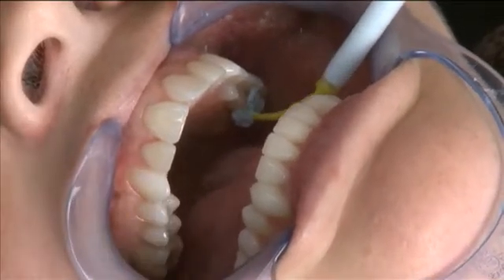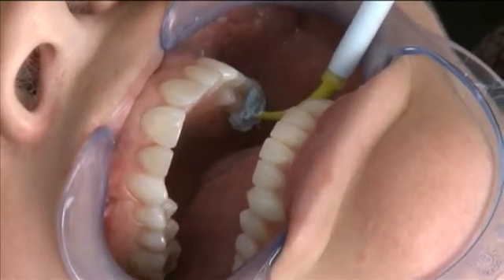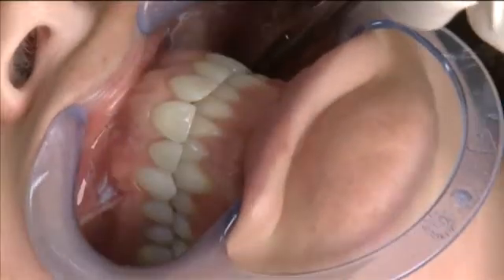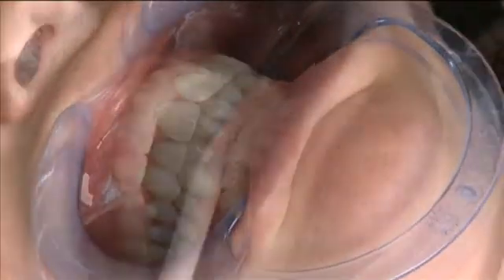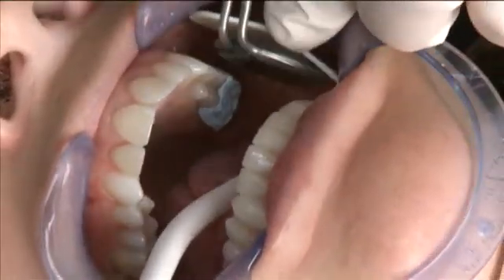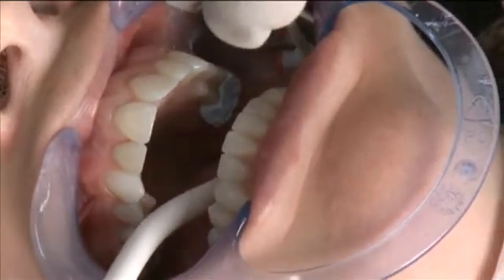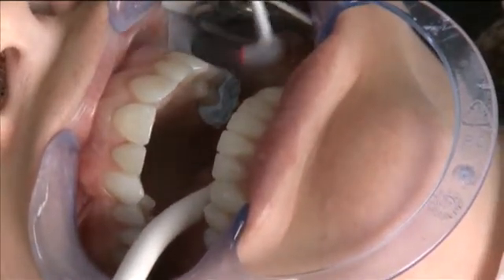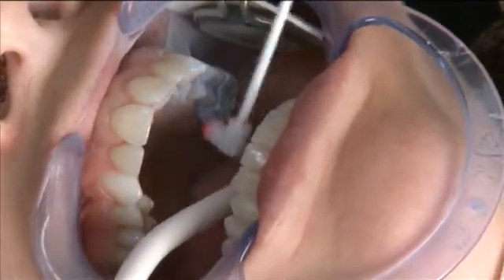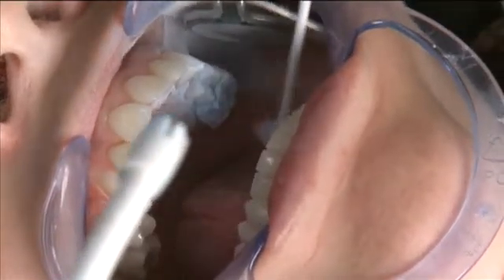After the bite registration has been injected, I'm going to have our patient close directly into the bite while holding shim stock on the known holding contact, as was done previously. Now that we've got a good bite registration, it's time to coat the area with OptiSpray. I'm spraying at about a 45-degree angle from a point distal to the bite registration across the buccal aspect, and then also at about a 45-degree angle across the lingual aspect, from the distal to the mesial, covering three teeth along the way.